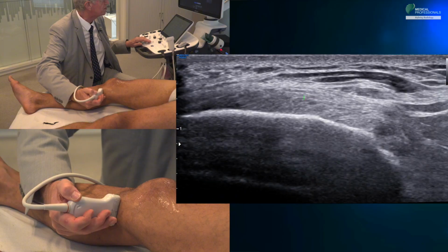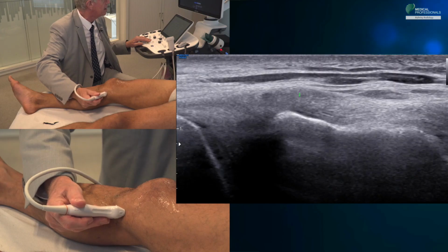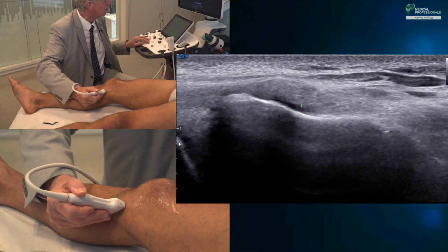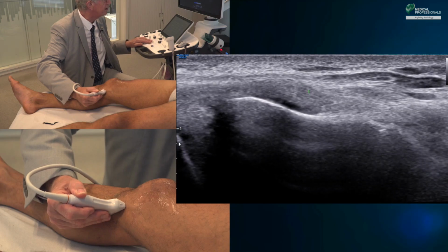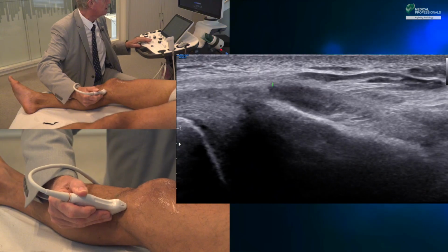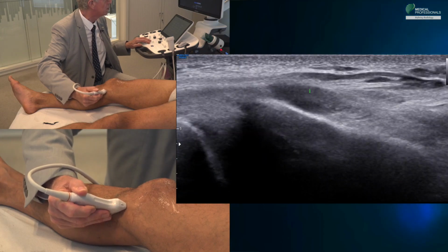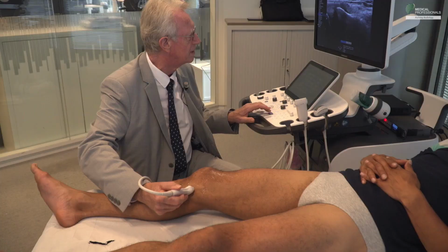We see here the fibrillar structure of this reflected tendon that is often affected in athletes and that is very poorly studied in MRI. This is because we are located at the edge of the section, and many pathologies of this reflected tendon are, in fact, poorly visualized on many magnetic resonance examinations. Here we find the posterior ligamentous expansions of the oblique popliteal ligament, which extend on the surface of this reflected tendon of the semimembranosus muscle.